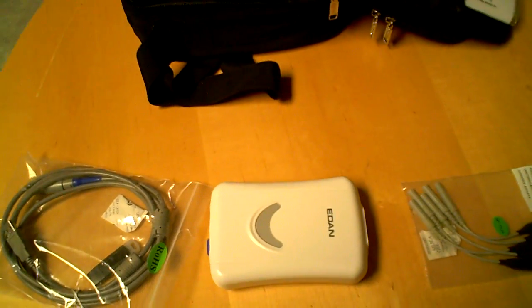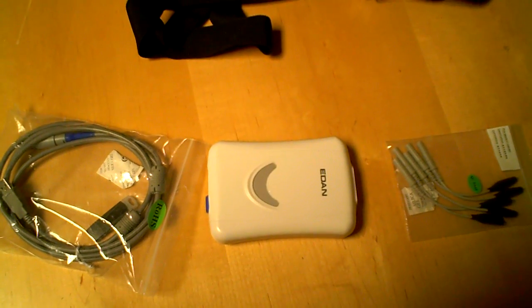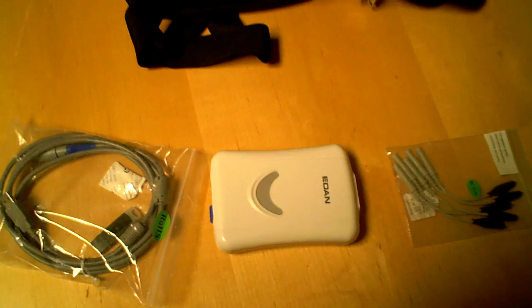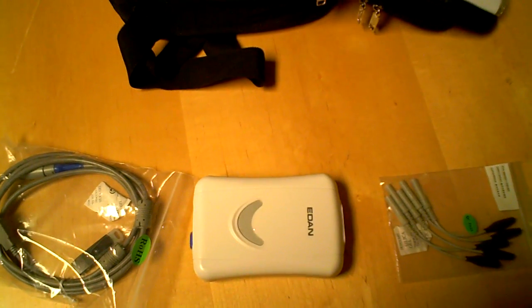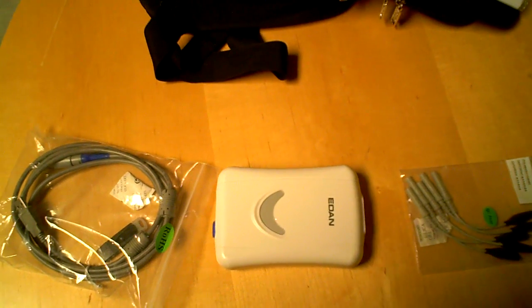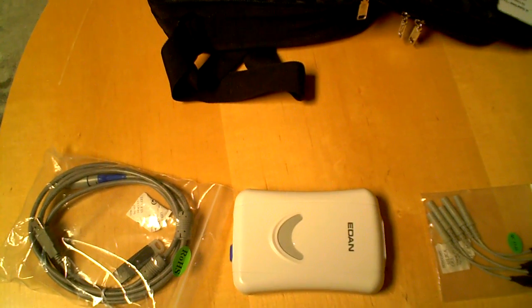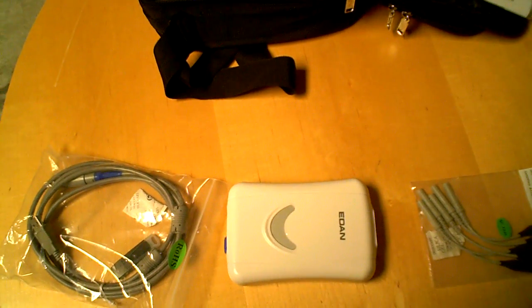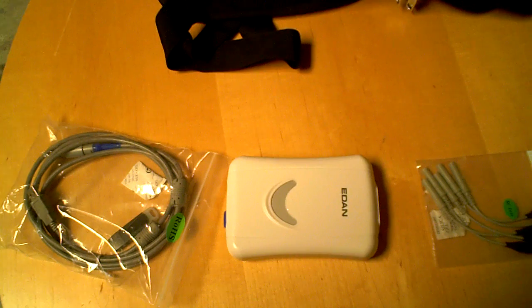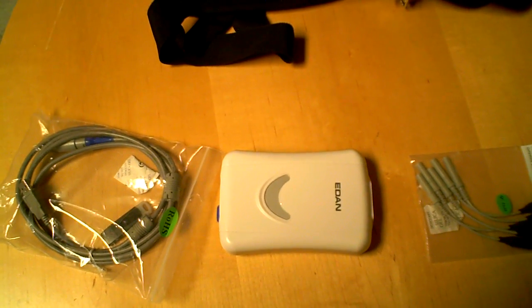Pretty easy setup here. One thing you want to keep in mind with these types of setups is that they can definitely give off irregular EKG patterns due to interference from either the PC that's connected to, your cell phone in your pocket, or the monitor that you're reading. So we're not huge proponents of these types of systems because they're not as accurate as just an EKG machine would be.